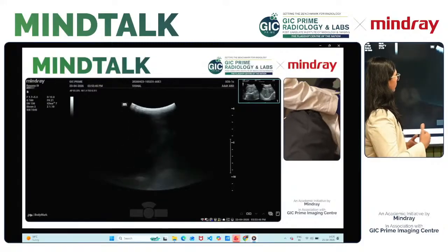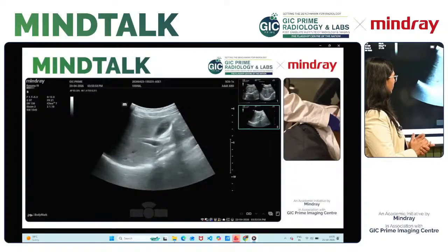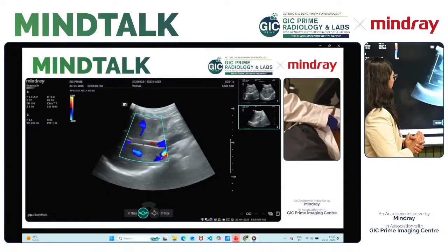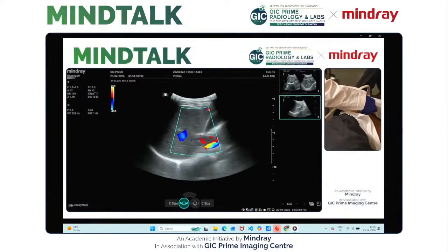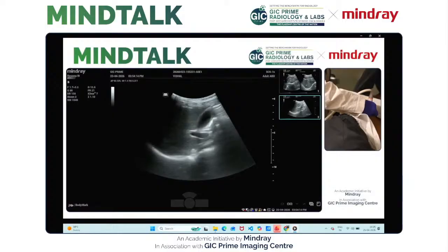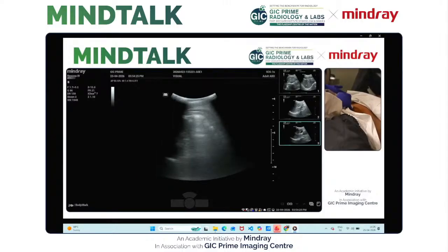I have asked the patient to turn on the left side to take the measurements. This is the portal vein, diameter is normal and flow pattern is also normal, hepatopetal flow. Hepatic veins are also showing good flow. Then I am measuring the common bile duct. It is not dilated. There is no evidence of any stone or stricture within the common bile duct.